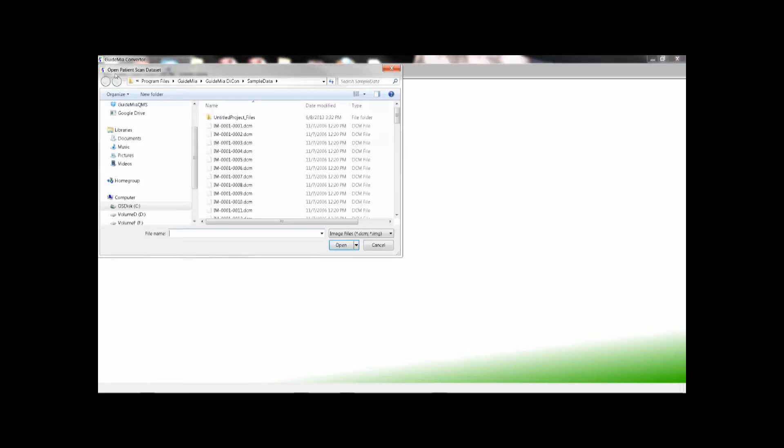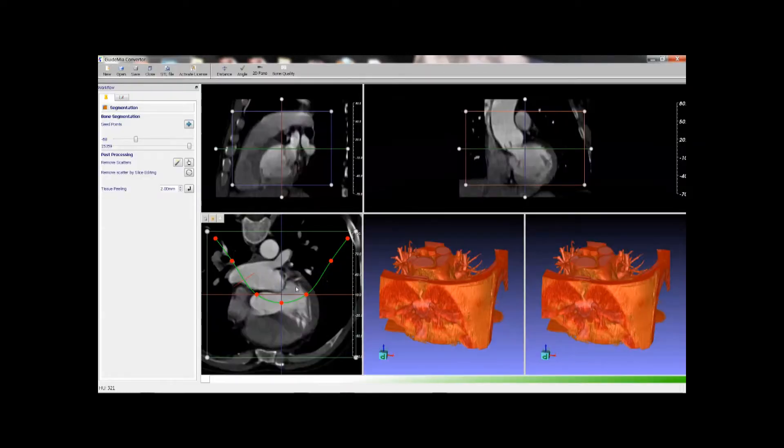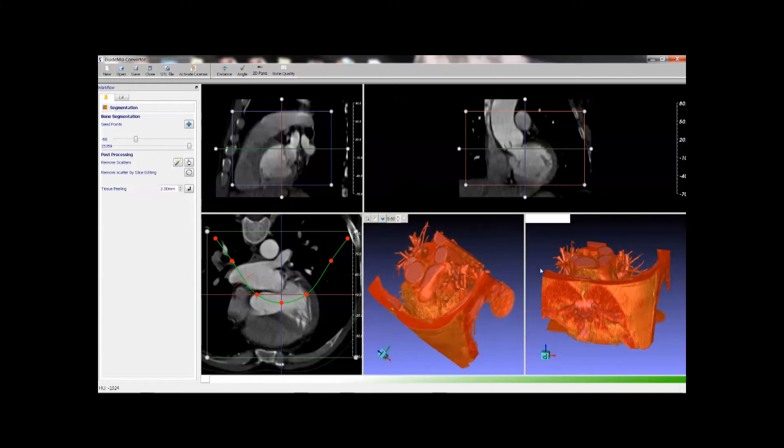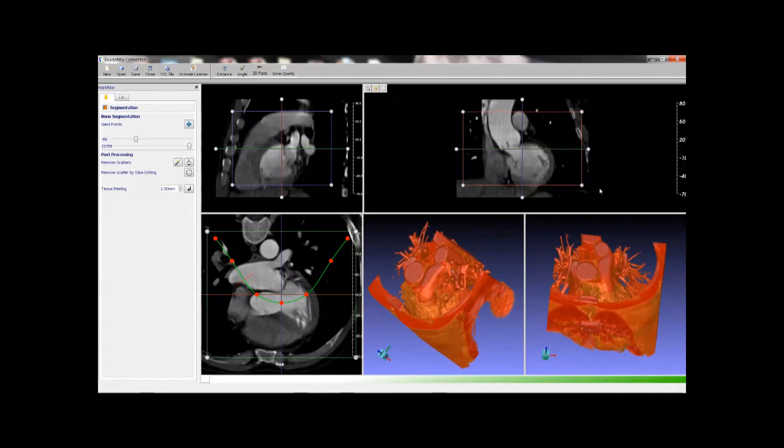First we open a DICOM data set by opening any of the files. Three cross-section views and two 3D rendering views are created. You can use left button to rotate 3D views.